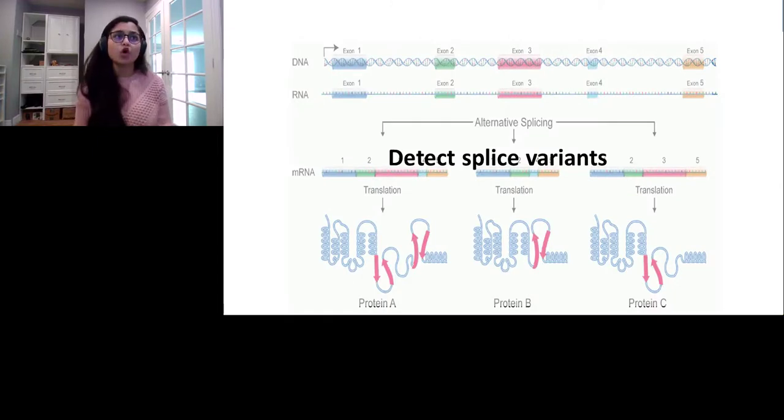Here's an example of how researchers used the BaseScope assay to visualize delta 16 HER2 splice variant in patient samples and stratify patients for Herceptin therapy. Tumors that have the delta 16 HER2 splice variant are susceptible to Herceptin. So using the BaseScope assay, they designed probes that would specifically identify the delta 16 splice variant and differentiate that from the wild-type HER2 receptor.